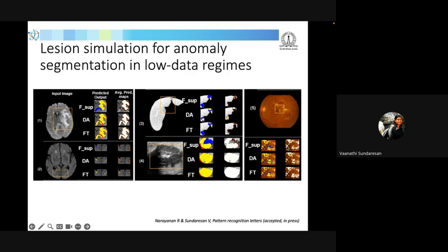So this shows that by adding some simulated lesions, or by adding more data for training, the model does much better. The confidence of the model goes up, and the detection capability of the model goes up. This is something we discovered when we were working on this: not only the number matters, but also the heterogeneity in the data matters to train a very robust and reliable model.